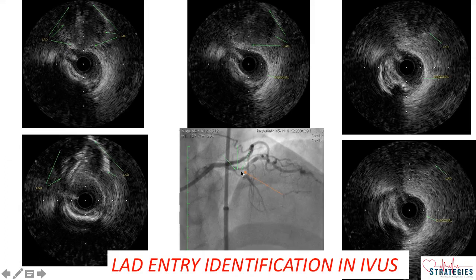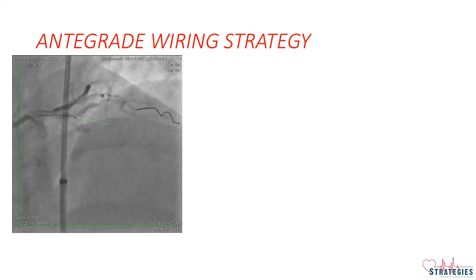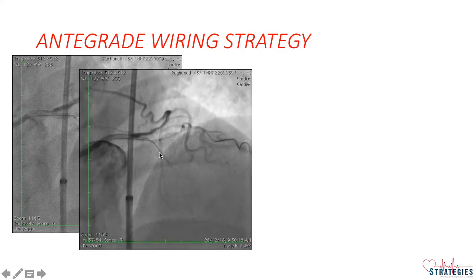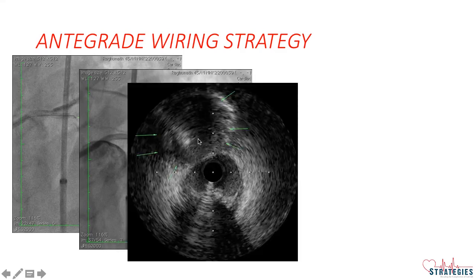With IVUS I confirmed this is the entry point for wiring and next we started wiring. Wiring can be done with IVUS catheter in situ, taking a Crusade catheter on the same wire, but you need an 8 French catheter for that. As I had a 7 French catheter in LMCA, I removed IVUS and passed Crusade and subsequently a penetration wire to enter into the LAD. This is a Hornet wire — I entered at the IVUS-identified entry point, we advanced it, and it looks like we entered true lumen. I passed IVUS to confirm — the wire is in true lumen, this is the media of LAD, and this is the wire.